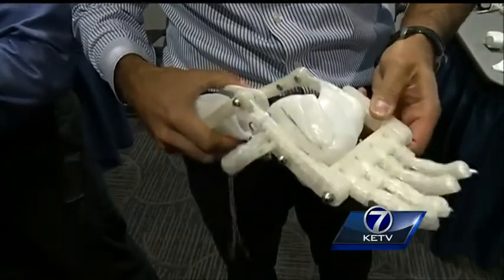Melissa Fry, KETV News Watch 7. Dr. Zuniga says the software and design of this hand is not and will not be patented because it's under an open-source license. Zuniga also teaches students how to make the hands, and he hopes to find funding to help as many kids as he can.